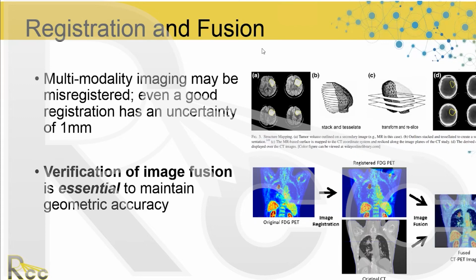Well, I'm a bit confused now, because I thought when we were talking about the MIP and the minimum, it was more about creating contrast for when you're contouring or creating a plan, rather than for the image guidance part, for the alignment part, right? Right. Okay. I'm going to make a little video that I'll share to explain how to do 4D CT contouring, and I think that'll help clarify the point for the contouring part. I think this course has really helped me understand what the areas of confusion are so that RCC can help clarify these. So really great questions.